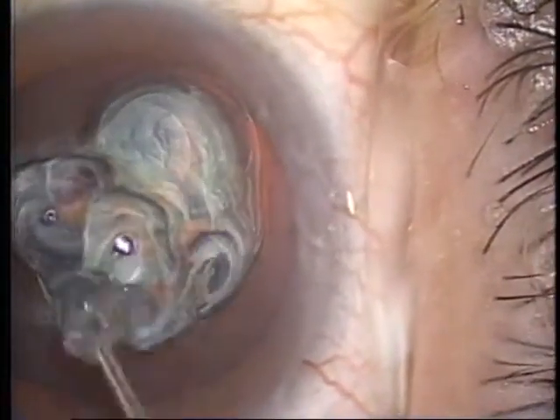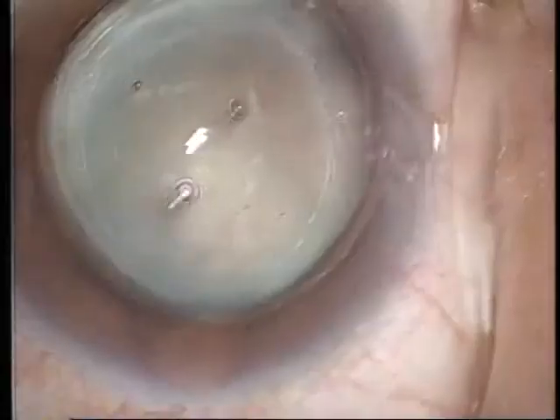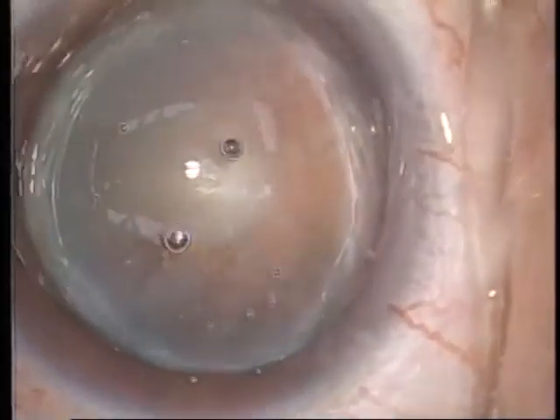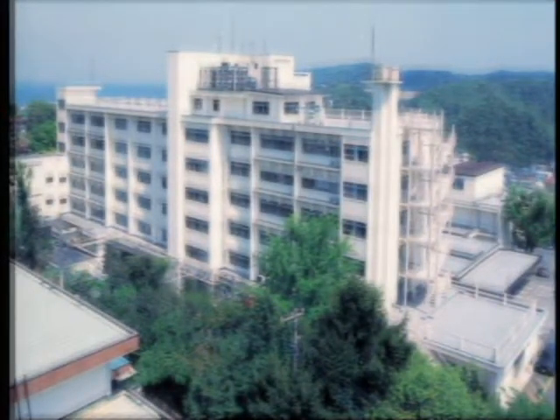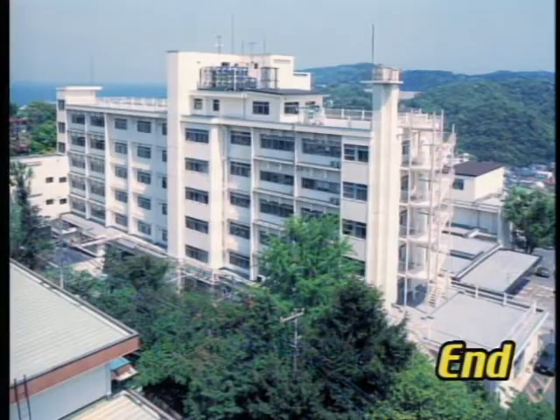At our hospital, surgery is performed by the wet shell technique without dropping perfusate on about 500 patients annually. Successful surgical results have been obtained with the visibility maintained without additionally wetting the cornea during surgery. The wet shell technique not only allows performing cataract surgery efficiently, but also has an action of protecting the corneal epithelium and an efficacy in healing wounds. I would like to further study these effects in the future.